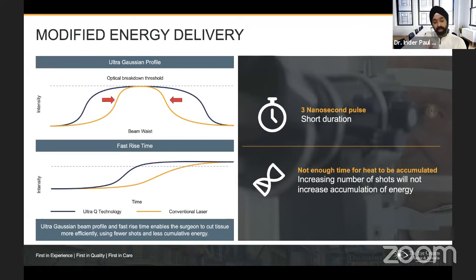So the point is we don't have an upper limit yet. I would limit it based upon the comfort level of IOP. But I'm going to get to pressure. It's a very good question. So thank you, and please feel free to ask more questions. This is really important, so thank you for that question. But to talk about energy, because that's a very important question.